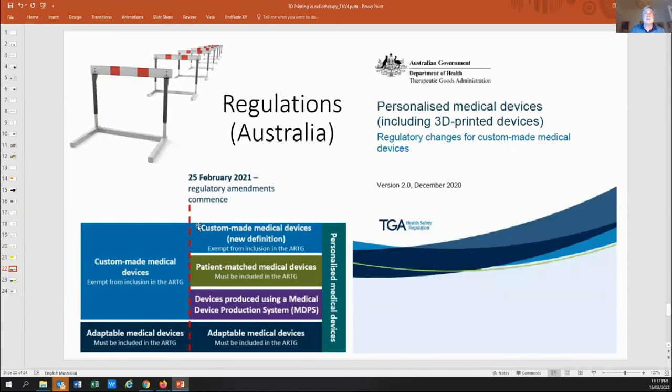I'd like to finish off with two slides about regulations, because after not being regulated for a long time in Australia and most of the world, regulators now have come to the conclusion that obviously if a place like Peter Mac does 1400 boluses or 500 boluses per year, then this is an important and absolutely essential aspect of our patient care. And that means there needs to be some guidelines, some processes in place which QA the materials, make sure that they're fit for purpose overall.